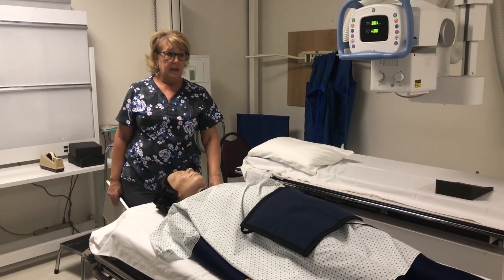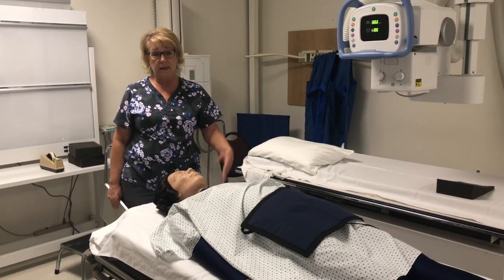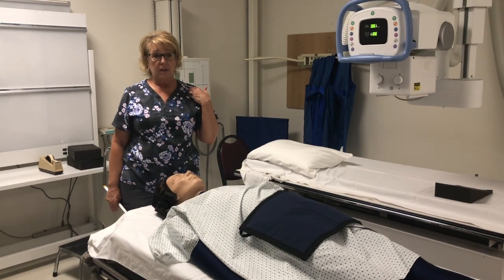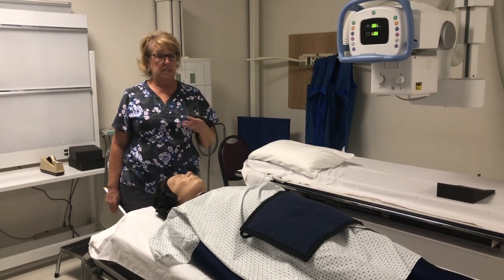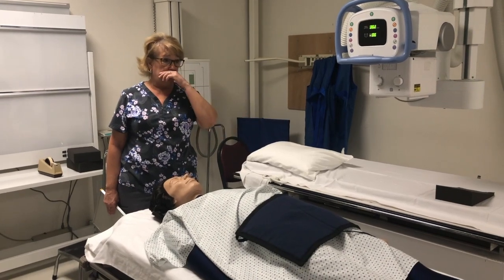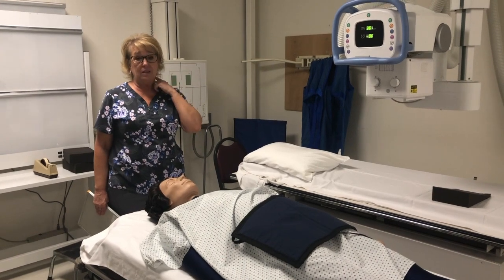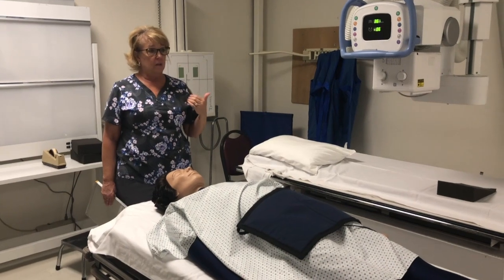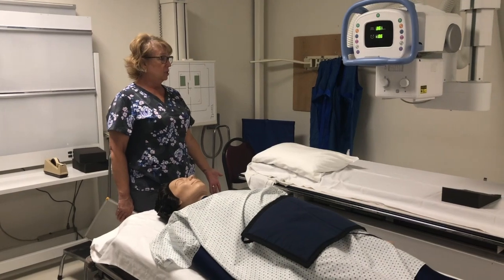Now, I think I mentioned that this probably isn't going to be very common because most spine imaging now, if there really is a suspected fracture, they're going to go to CT. But there may be that occasion when CT's slammed, maybe CT's down. And you're working with a trauma patient and the physician really needs to have oblique views. They really need to see those intervertebral foramina. This is a way to get it on a trauma patient without rolling them into an oblique.